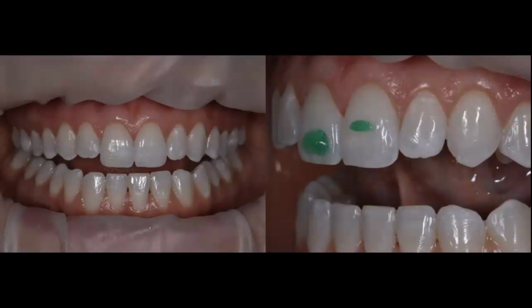And you just follow the manufacturer instructions. The idea is that this etching is going to penetrate through that white spot, and again, you can see that it's very localized. This etching is very thick, so it stays there. It's not runny. It's actually right on top of the white spot. You can see that I've selected 2 drops, different sizes depending on the size of the white spot. Leave it there for a couple of minutes.